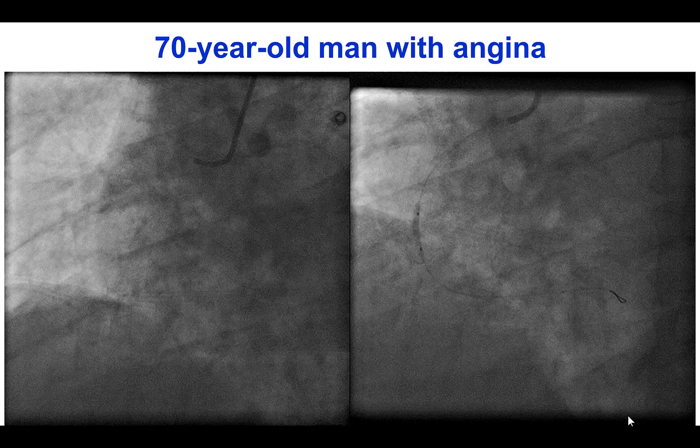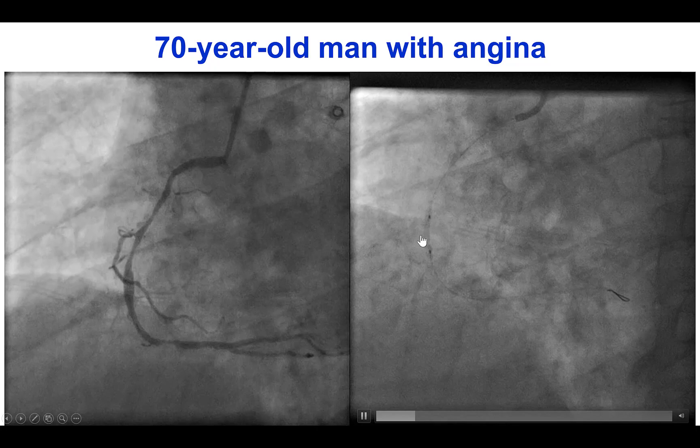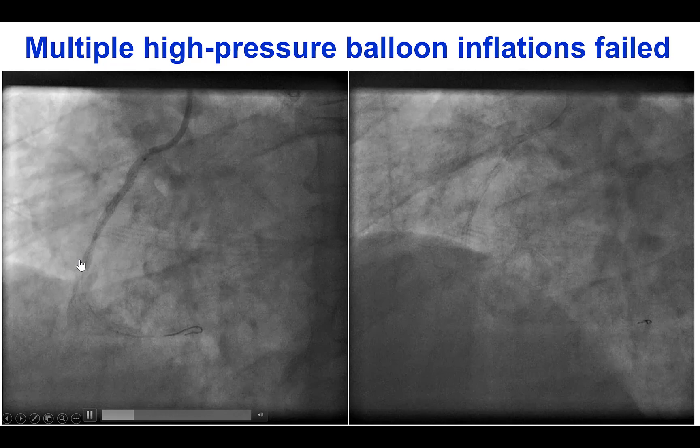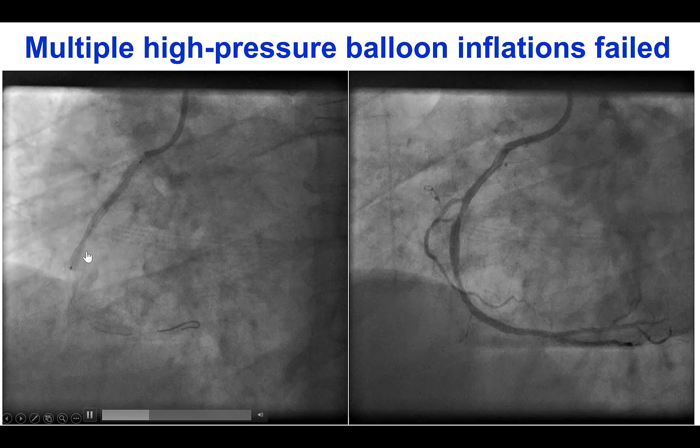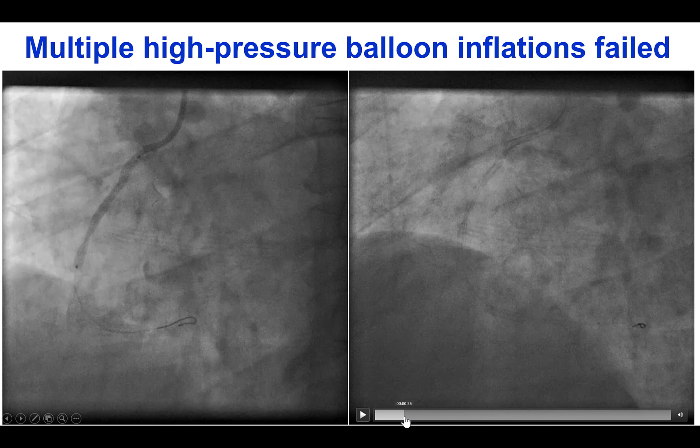The patient was an elderly man who presented with angina and was found to have significant disease in the right coronary artery. He underwent predilatation with an undersized balloon and then had placement of a drug-eluting stent. However, despite multiple high-pressure inflations up to 26 to 28 atmospheres, that mid-right coronary artery area could not be expanded. You can see even before contrast is injected into the vessel that there is a significant stent under-expansion in the middle portion of the stent.